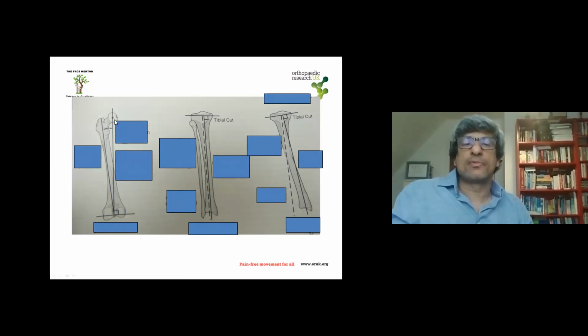This line represents the mechanical axis, and this represents the anatomic axis, which goes down the shaft of the femur. Then carry on and tell the examiner why these two lines are important: my goal of knee replacement surgery is to place my femoral component at 90 degrees to my mechanical axis. However, in real life, as a surgeon, I would be using the intramedullary rod for my instrumentation, which goes up the anatomical axis. Hence I'll have to dial in the difference, and that difference is between 5 and 7 degrees, and that's called the valgus cut angle.